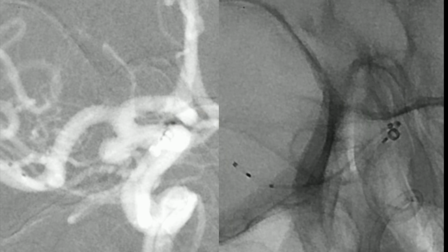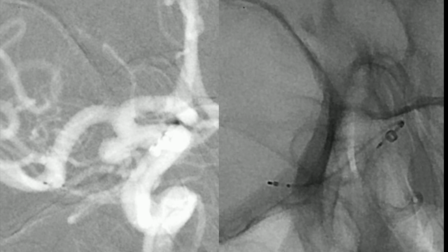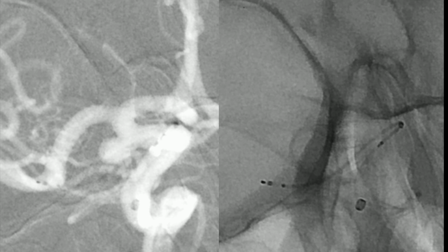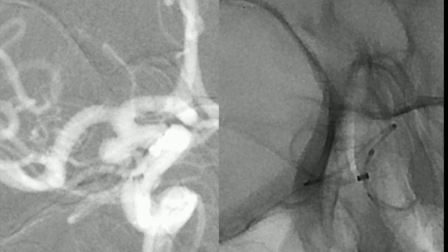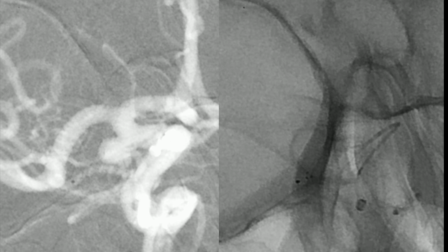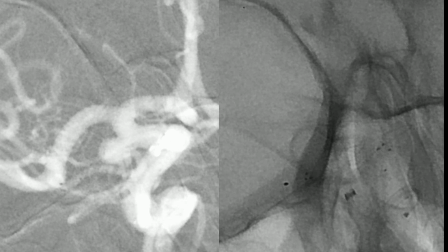And now we're starting to implant the microstent. We pull it a little bit back with the microcatheter so that we have a good basis in the ICA. We don't need that much distally in the PCOM. And now we are unsheathing, and so we have unsheathed the stent completely and implanted the stent.